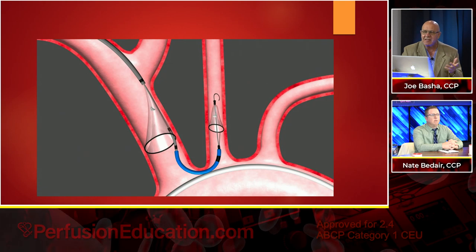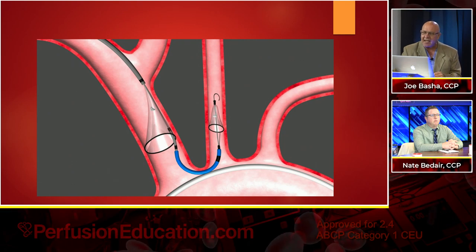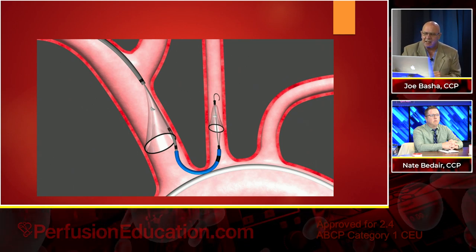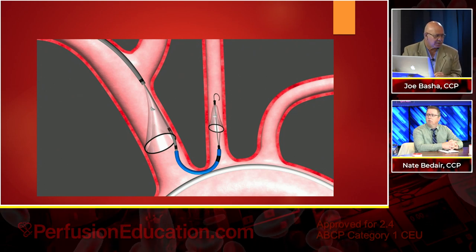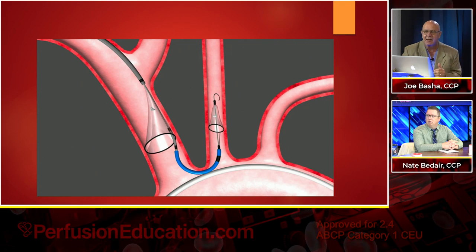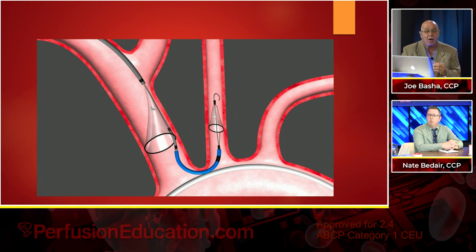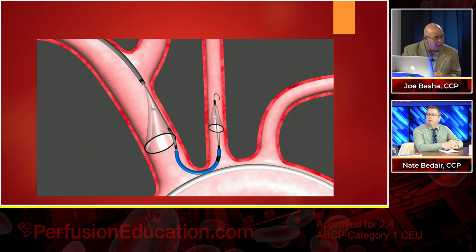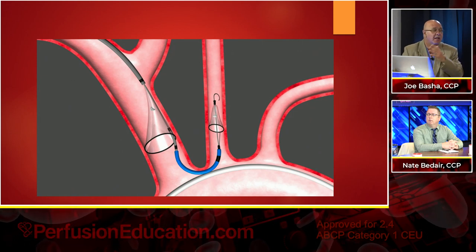Now, you have this device. This is the Sentinel device. It's put in through the axillary artery, and one stays in the innominate, and the other one goes up into the left carotid. And what that does is actually capture any embolic material that goes up. Now, the limitation of it is there's nothing in the left subclavian, and of course the vertebral comes off the left subclavian, so you still have some risk. You also have risk putting it in, because you will also have a shower of some embolic material. But will it be the same load as it would be putting that big TAVR in?